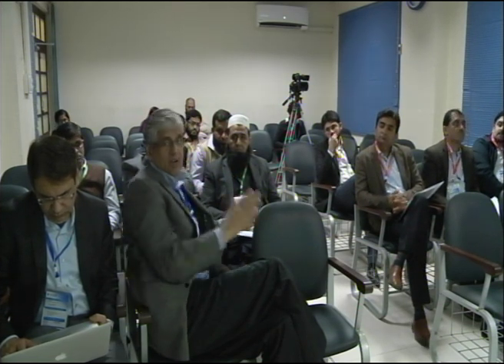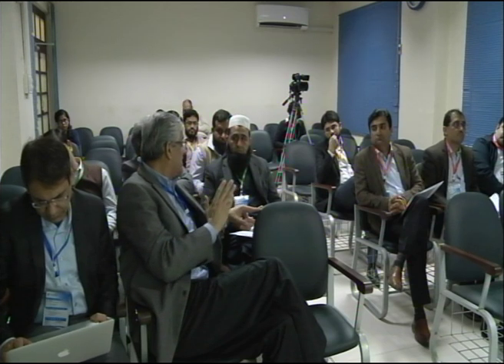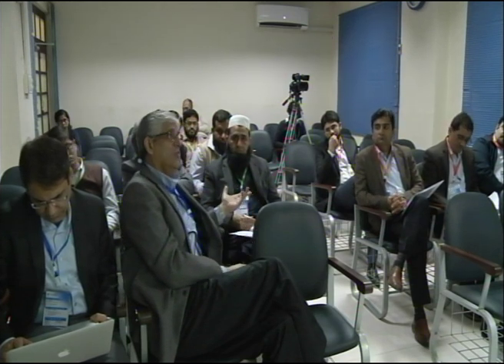If your failure is 4 or 5 out of 10, you should not be doing ERCP. Correct me, sir, if I'm wrong? Absolutely. Anybody doing cannulation and not able to do less than 9 out of 10, should he be doing ERCPs? No. Are you at that level? And if you're not, take a step back. And if you've done it enough and you're still not reaching, call it a day. You might be better in colonoscopy.